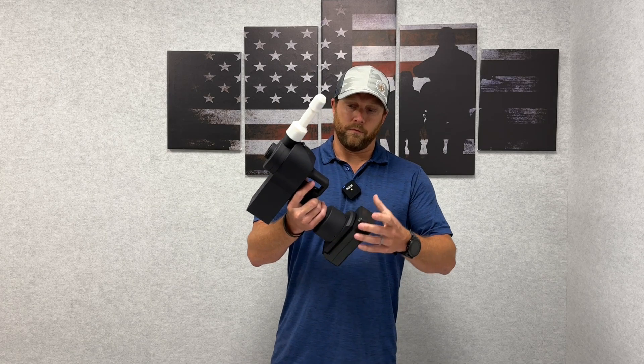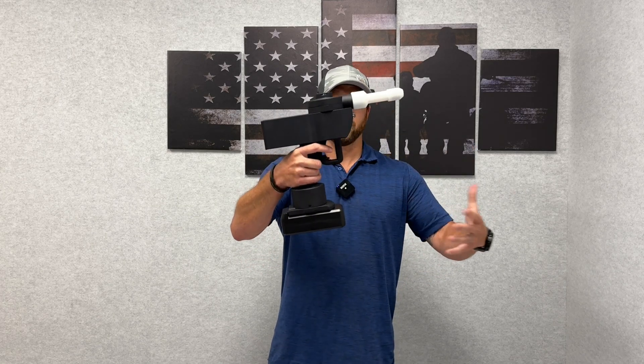We took a known form factor — similar to a DeWalt drill that everybody knows how to use and has probably handled in the past — built it off of that, and for the last roughly seven years we have been validating and testing the technology and what it can do.